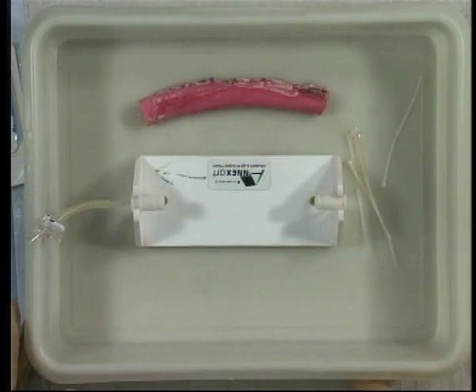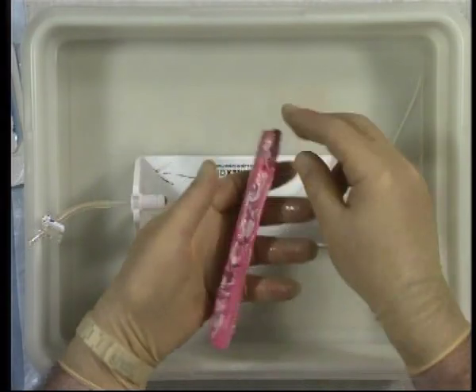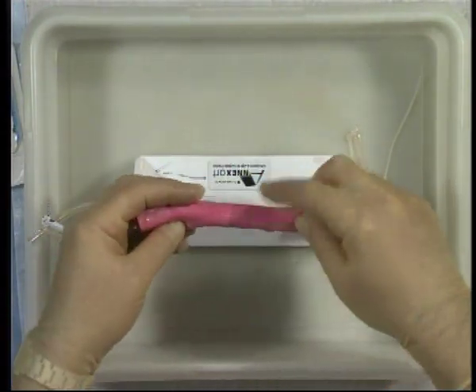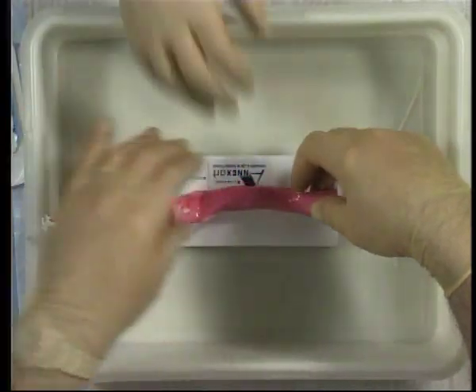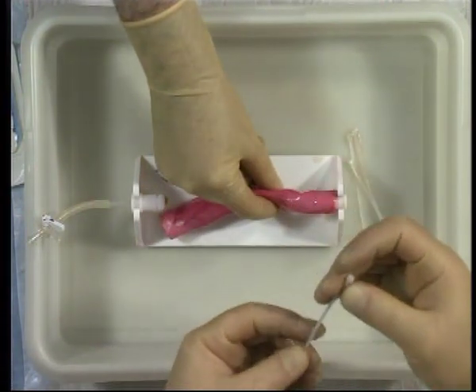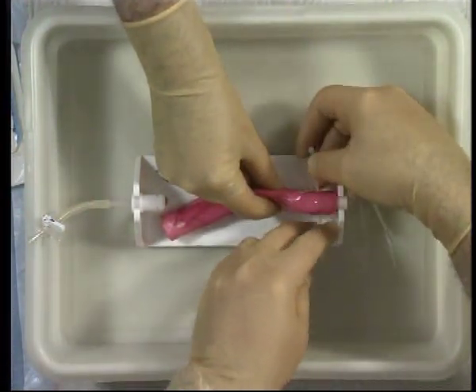For this you will need an annex vascular jig which has been modified by having one of the spigots bored out, allowing it to be connected to a drip set. Your pig aorta has previously been prepared by having all the vascular branches ligated, and is mounted on the jig and secured with cable ties or heavy silk ties.